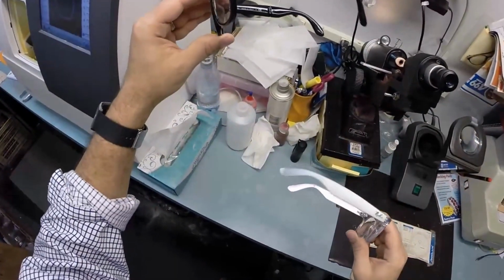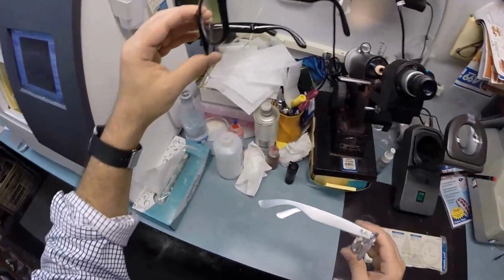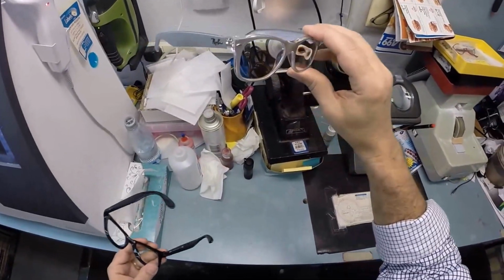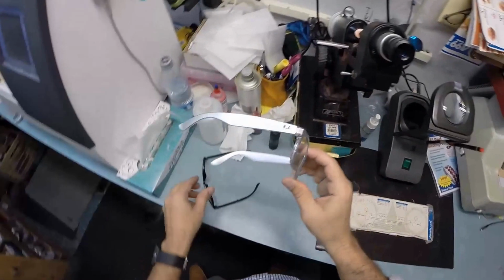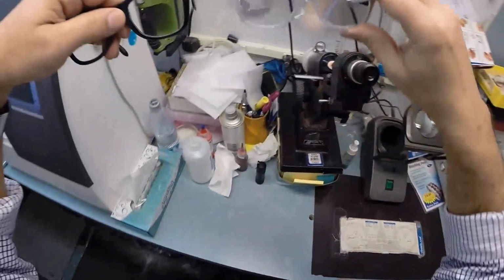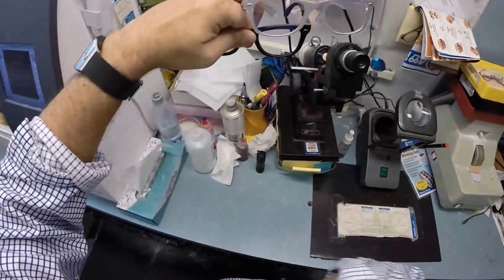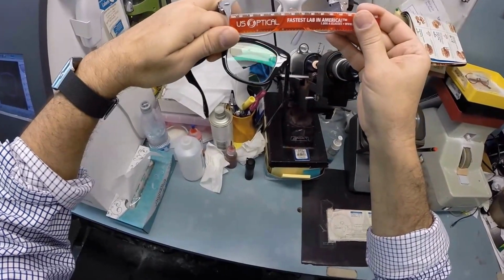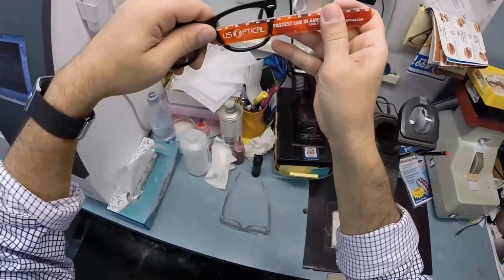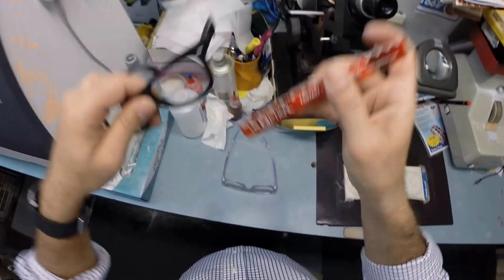Plus, they lightened this frame up a tremendous amount. I always thought that the original Wayfarer was somewhat heavy. This one is so much lighter, it feels like my 2132 New Wayfarer. Of course, I'm wearing color 6144, which is the silver metallic. Now, we'll put it back on so I can see what I'm doing, but first, you can at least see the shape. My frame's a little more rounded in a 52 eye size, and that's 52 millimeters from the corner of this lens to the corner right here. This one measures 50 millimeters from the corner of this lens to this corner. That's where we're getting 50 millimeters from.